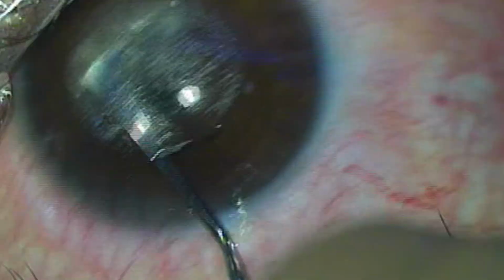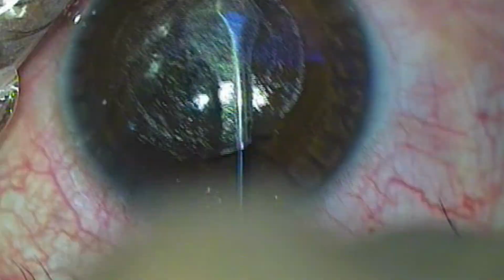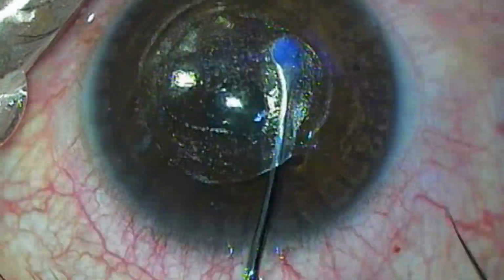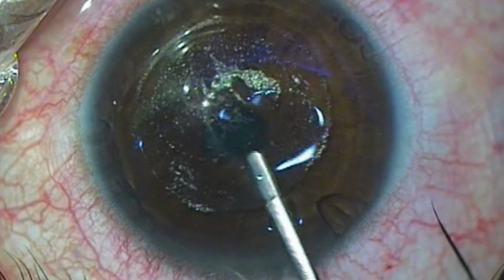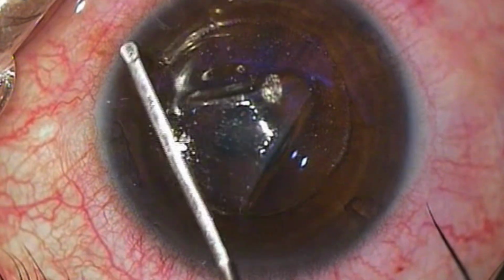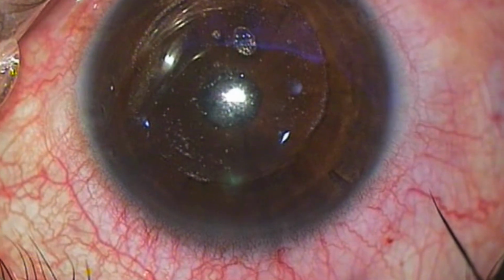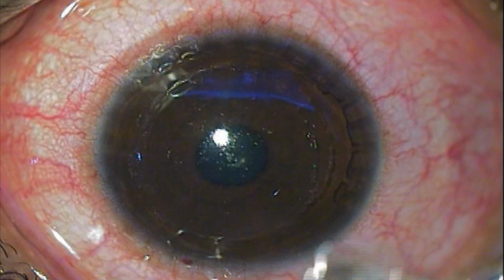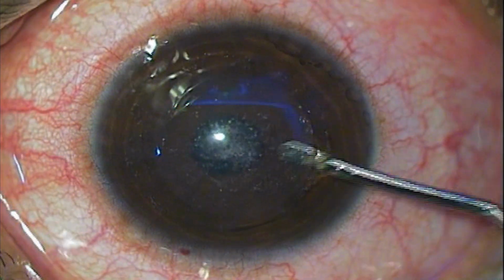Here are a few demonstrations which show how a simple idea can make a huge difference in the reduction of complications in SMILE surgery. Once the proper dissection of the floor and the cap of the lenticule is done, the hydrocannula is introduced and the saline is injected, which aids in smooth retrieval of the lenticule. This lenticule is now placed on the cornea to show the intact edges of the lenticule. Another example of the same technique, which is simple and reproducible, leading to the extraction of the lenticule in totality without any cuts or tears.